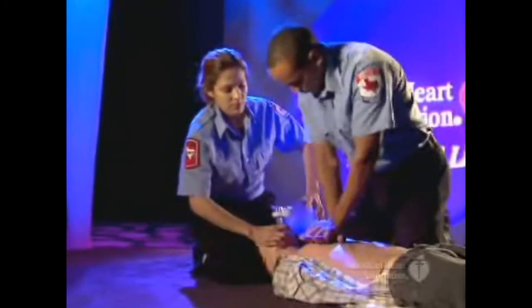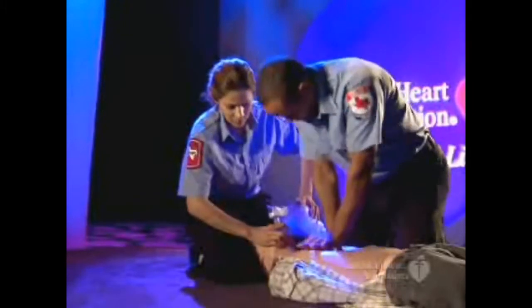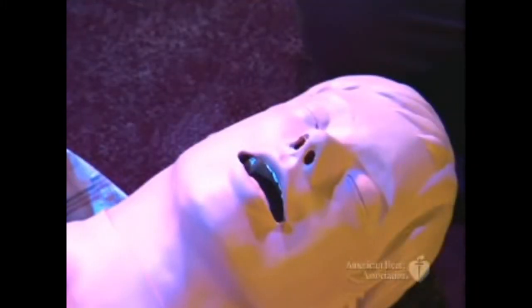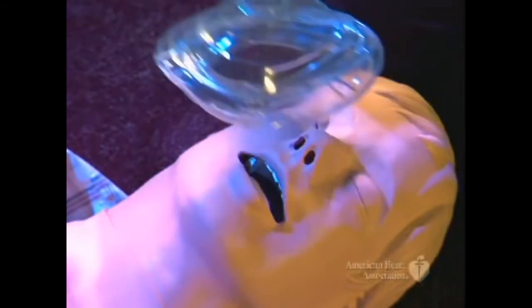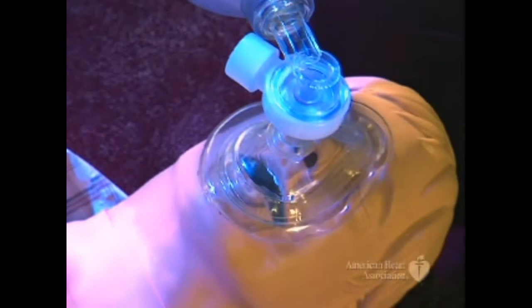Here's your chance to do it. As before, practice along with the video. Are you ready? Here we go. First, position yourself directly above the victim's head. Place the mask on the victim's face using the bridge of the nose as a guide.